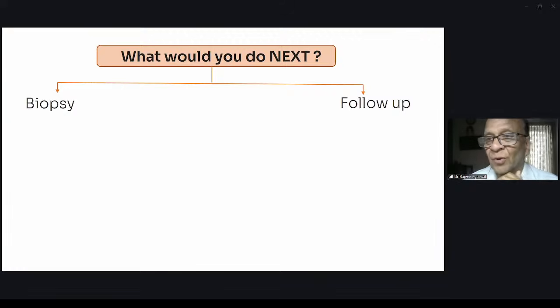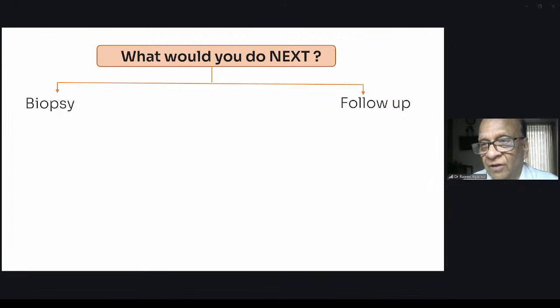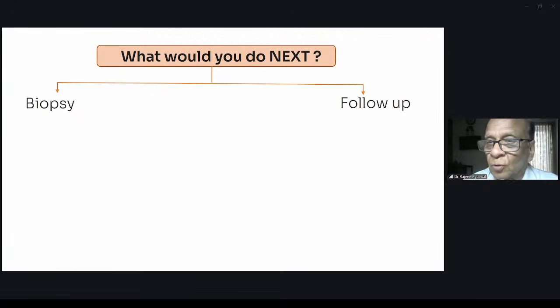So which biopsy will the experts recommend? Mammographic stereotactic or MRI guided? If you have MR guided vacuum assisted biopsy, you could. We have every facility with us. It depends on where you're most confident you're seeing the lesion. If you're seeing it on tomography, you can do a tomography guided VAB, and you don't need to do an absolutely MRI guided VAB.